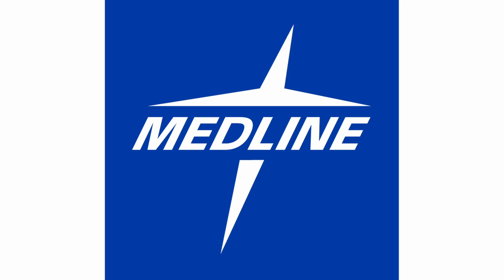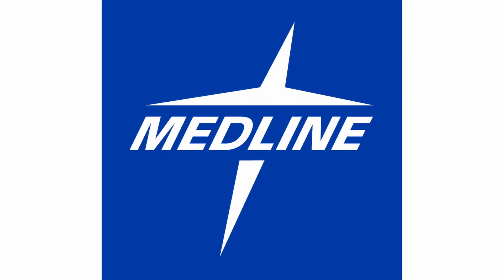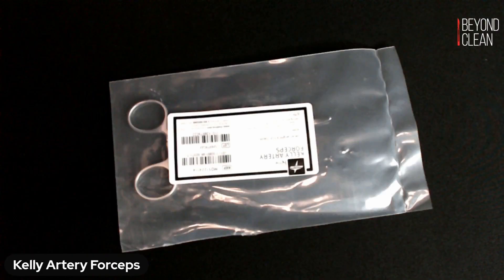The instruments featured in this Hello My Name Is video series are brought to you by Medline, Koenig and First. Hello, my name is Kelly Artery Forceps.